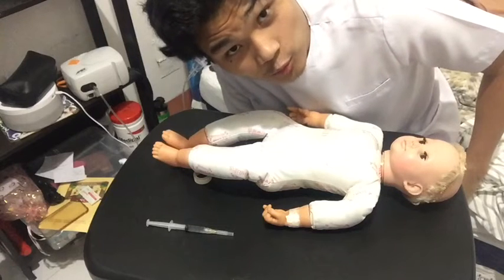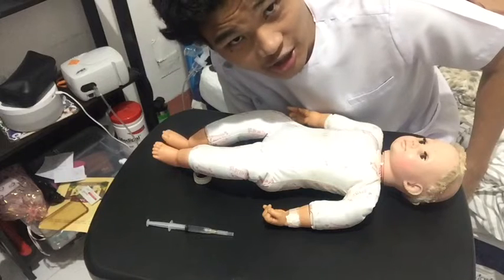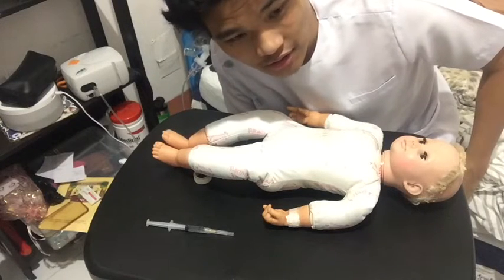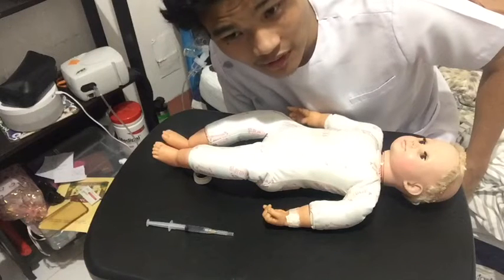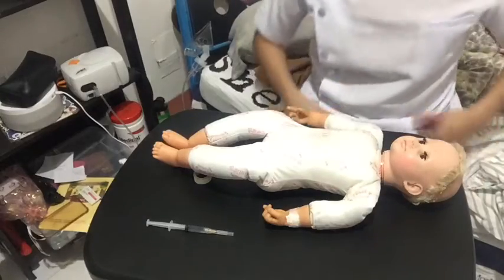But the first step that we're going to be doing in the performance phase is proper hand hygiene. The purpose of this is to avoid any further infections and to keep the area or the procedure sterile, free from microorganisms.